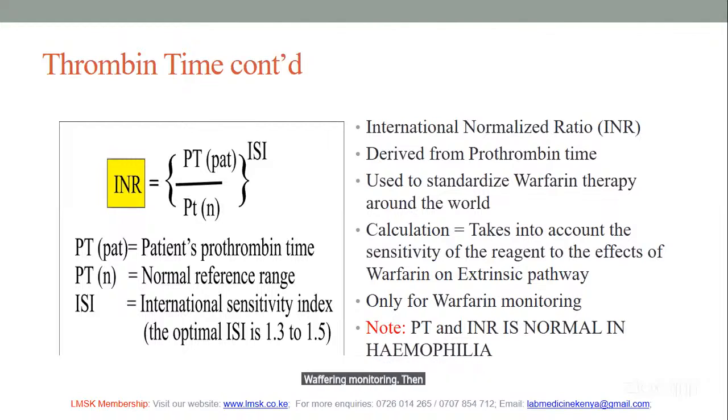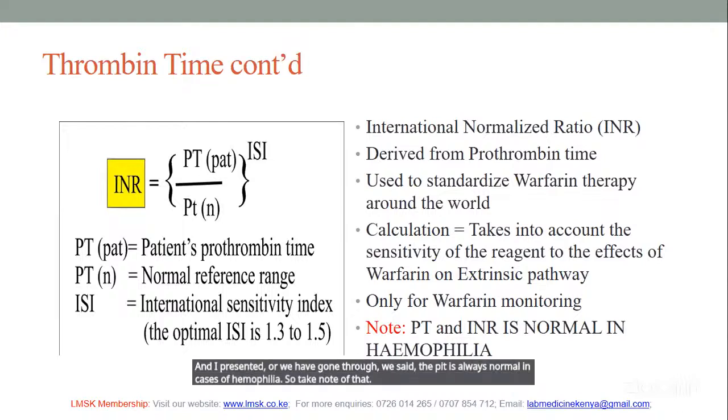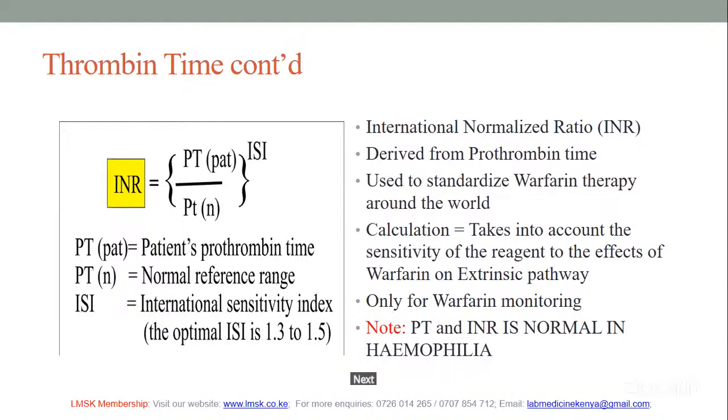Then note, PT and INR are normal in cases of hemophilia. This is very important to us because some people will report they see abnormal results and presumptively think that the client has hemophilia. From the slides that we have gone through, we said the PT is always normal in cases of hemophilia. So take note of that. Next slide, please.